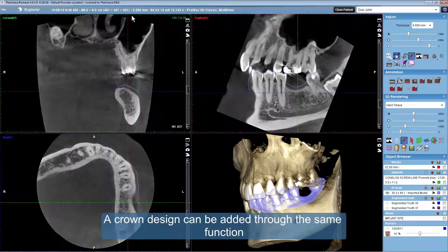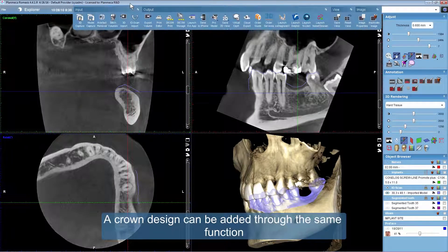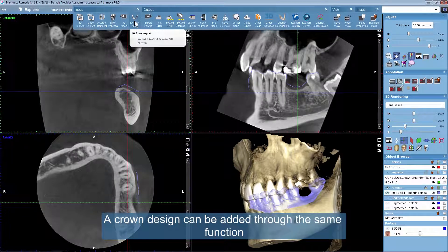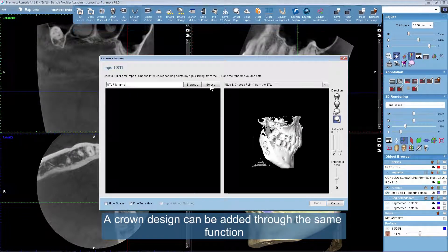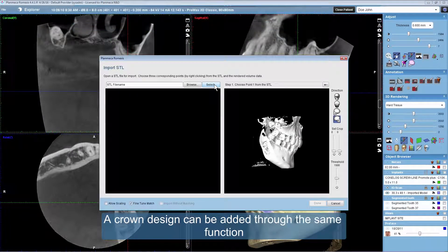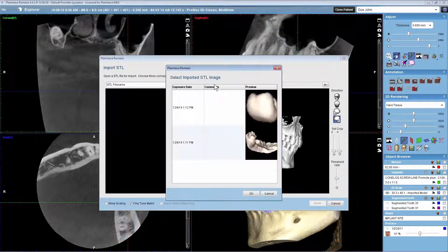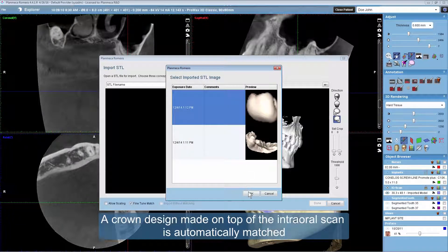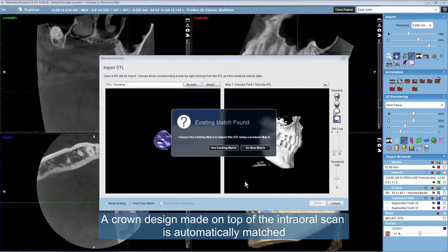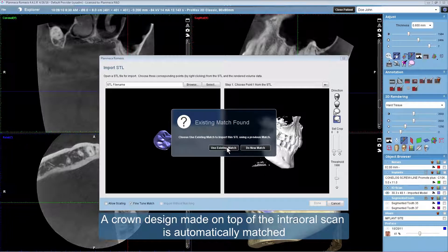A crown design can be added through the same function. A crown design made on top of the intraoral scan is automatically matched.